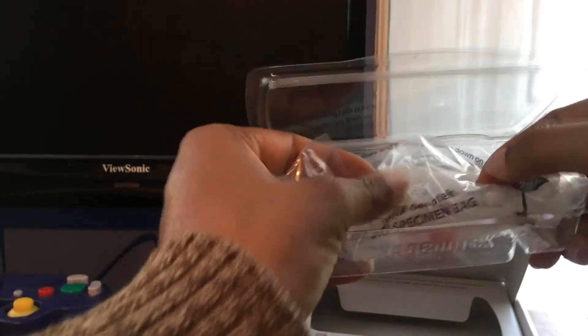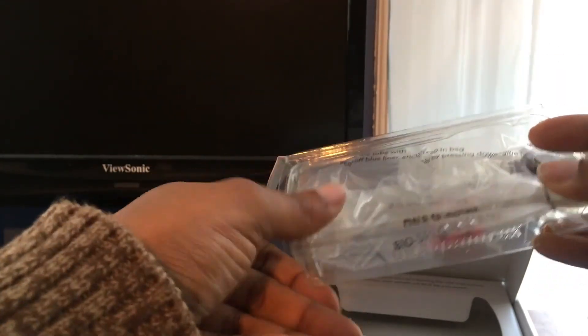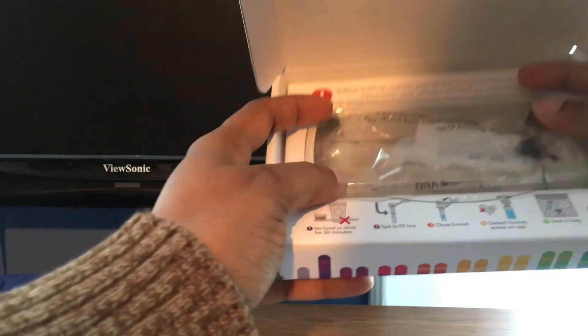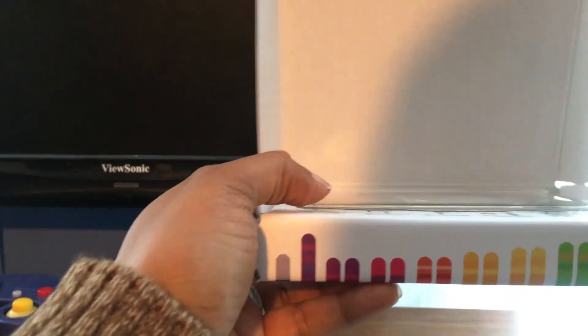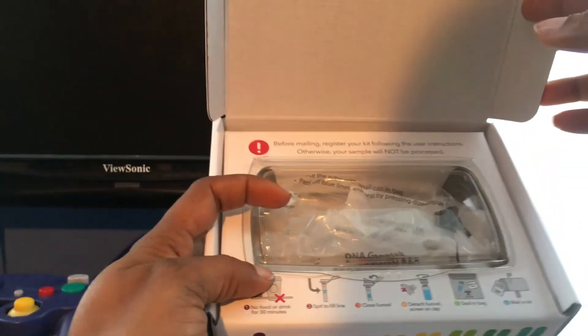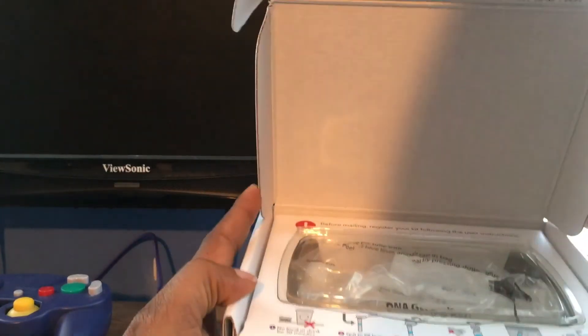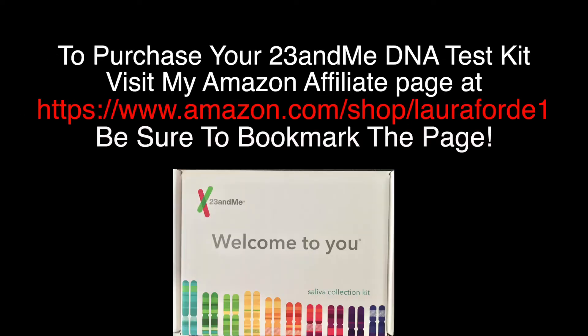I had to squeeze out some of the air, but it fits. Put it back in the box, peel the strip to seal the box, and then just take it to the post office and mail it off.